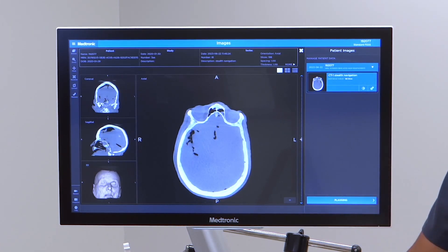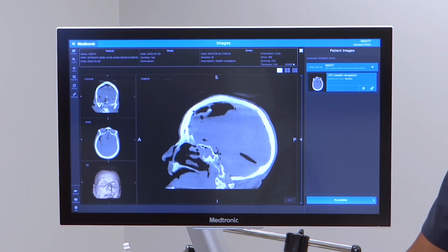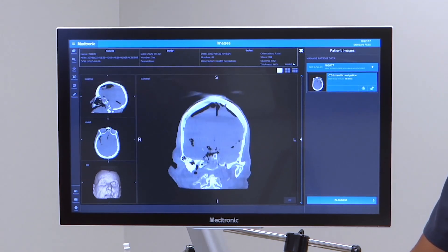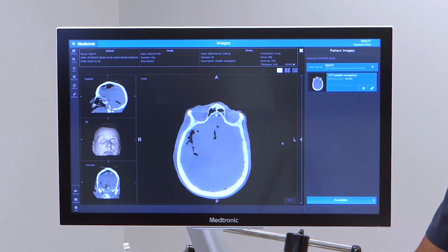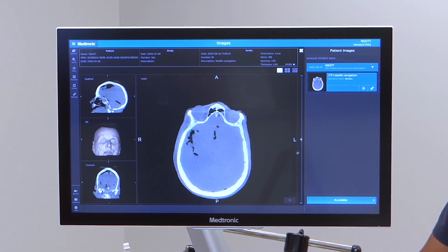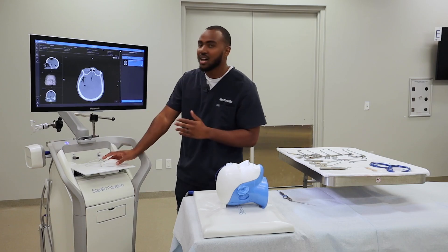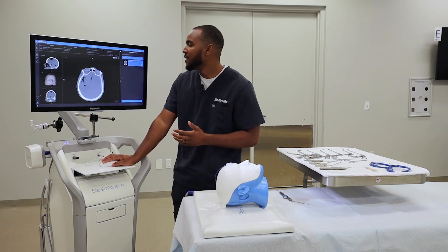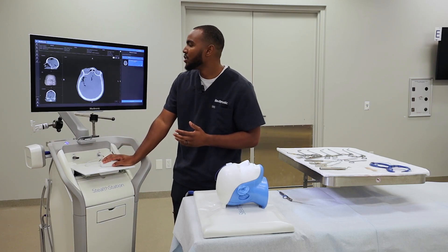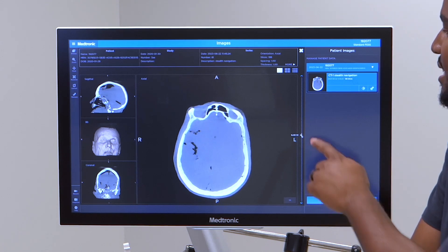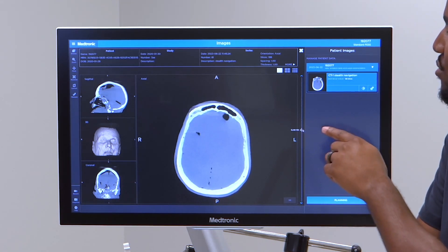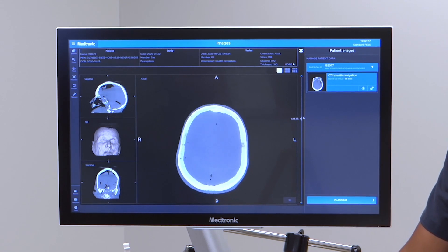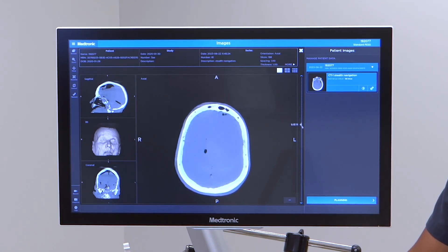On this screen, you can click and drag any of these CT scans to the center. You can also click and drag the 3D image, and you can use either your hands or the mouse — I'm using the mouse at the moment. You can use the white hash mark on the right-hand side to scroll through the different slices.